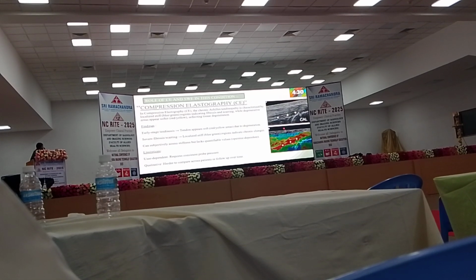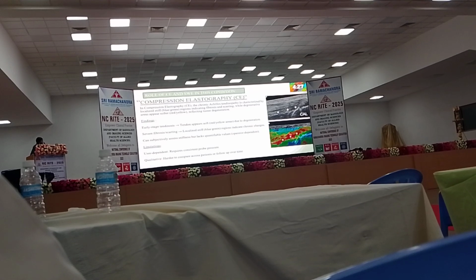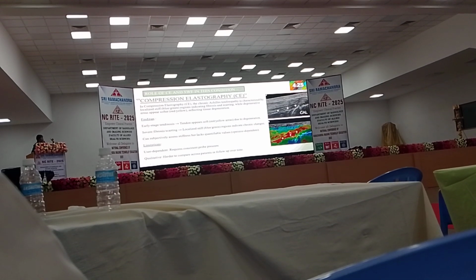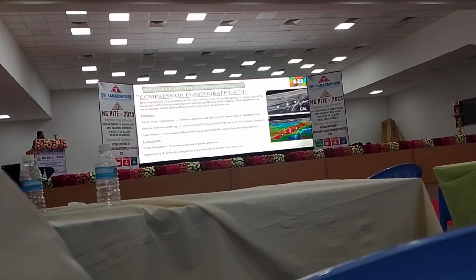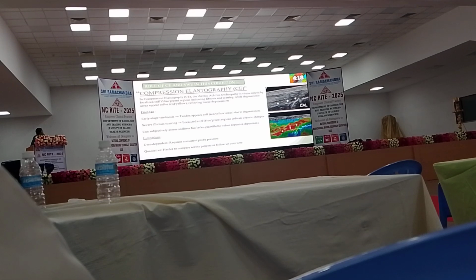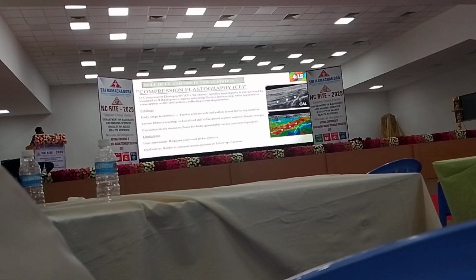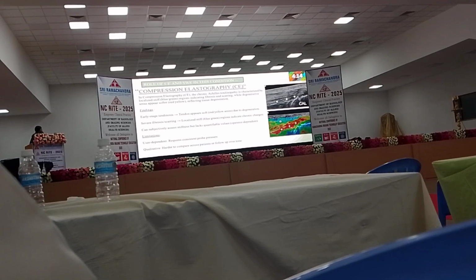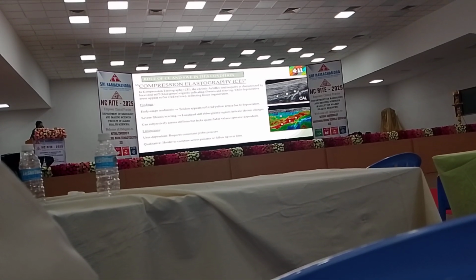Here, we can observe the area just red and yellow in the elastogram image, showing the tendon being soft. This has been caused due to degeneration of the tendon, and this can lead to a condition where early stage tendinosis is being found. Now we're talking about the blue-green region of the tendon. This is due to chronic changes, and these chronic changes can lead to localized stiffness of the tendon region.